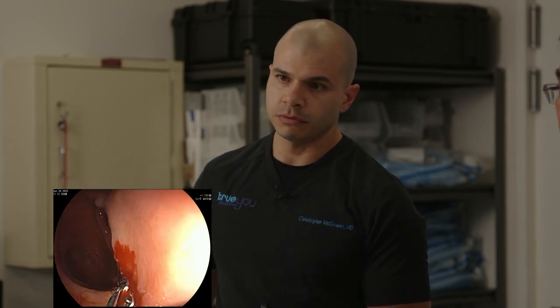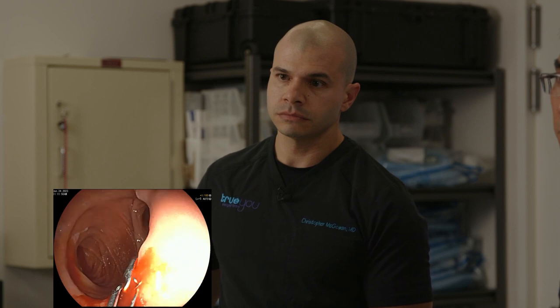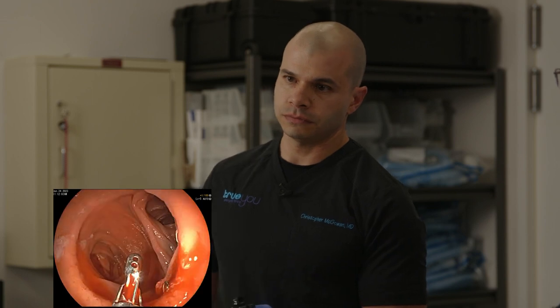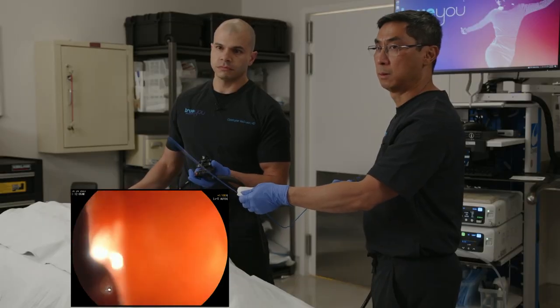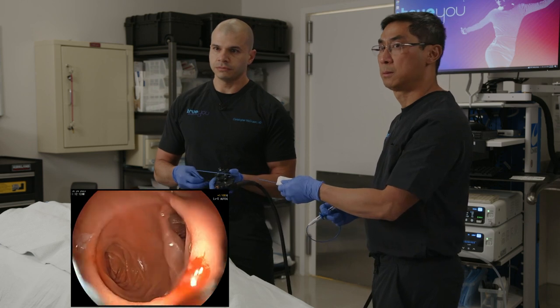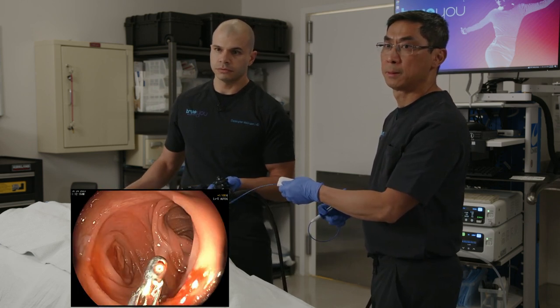So this other staple, we'll try to grab and remove, though it's not protruding quite as much. Open. And close here. And one more time there, open. Close. It doesn't want to come out, but that's okay. Yeah, there it is, open.